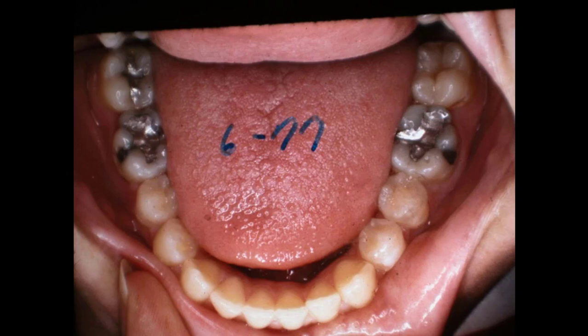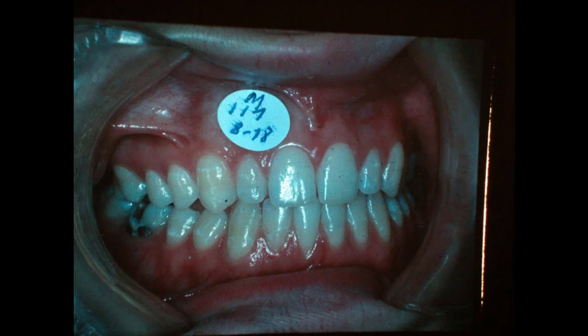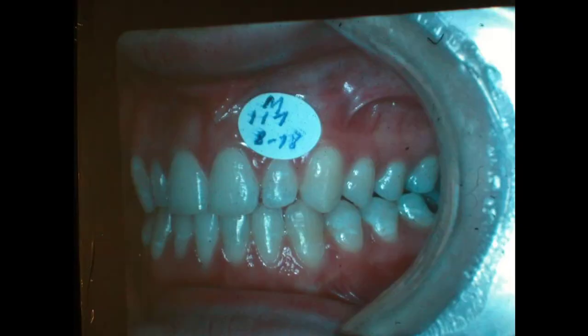And we did this without any surgery at all. We did it with a palatal separator and archwires that expanded. And here it is in 1978 — these teeth are coming down. In about another 2 or 3 years, the teeth grind in, and then we put retainers in there. We usually don't even use a lower one, but we bond them all 3-to-3 inside now. And there it is in 78 — they'll come down closer.